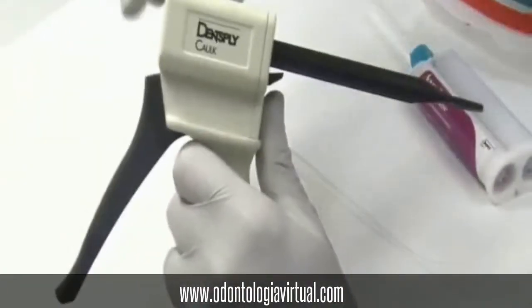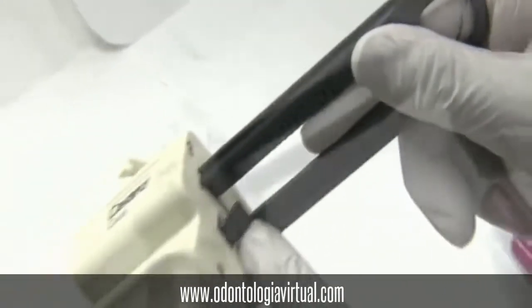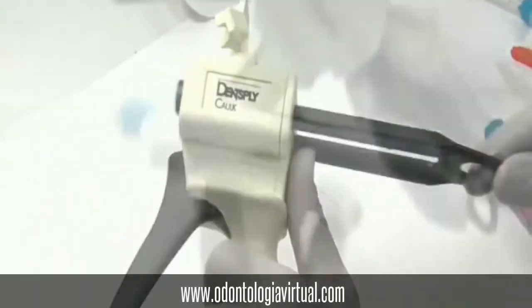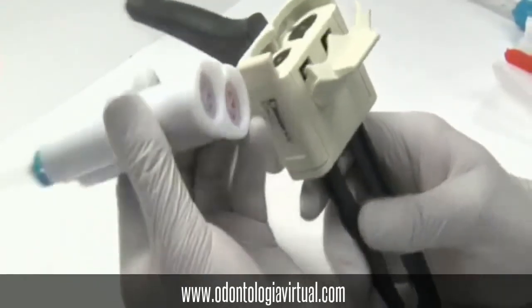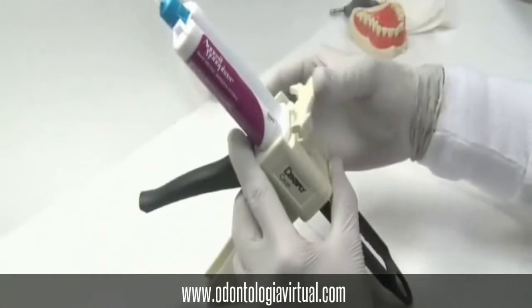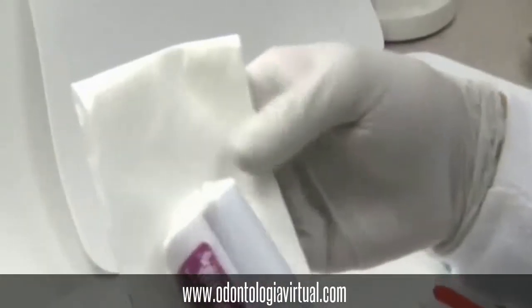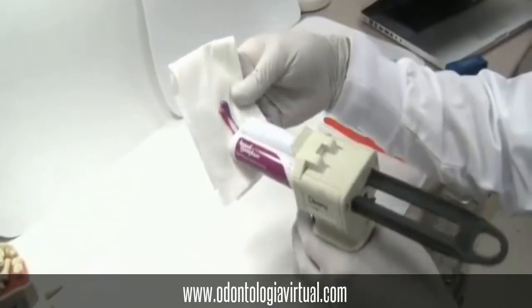When you load the cartridge into the gun, lift the lever and in the back there's a release button that you will have to push so that you can push the plunger in and out. Align the notch of your cartridge with the corresponding notch of the gun and lock that in place. Now push the button and push the plunger all the way in. We have to bleed the cartridge first, so slowly squeeze a little bit until both the catalyst and the base come out at the same time.